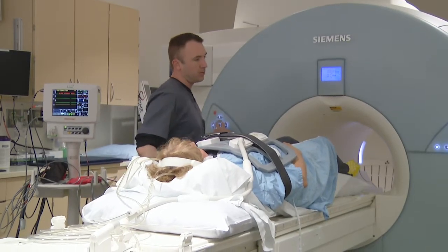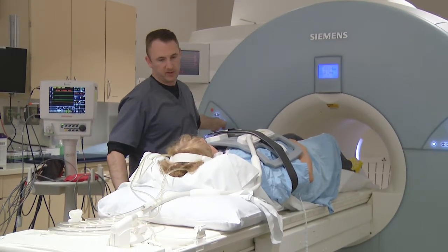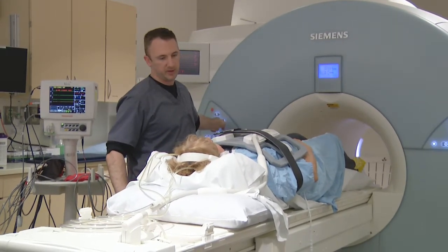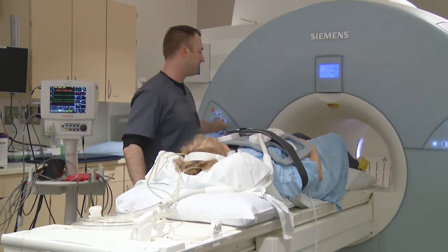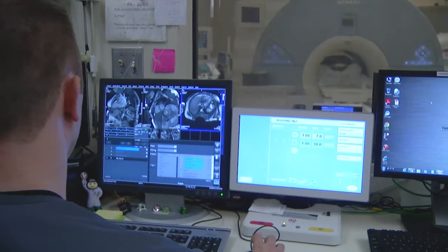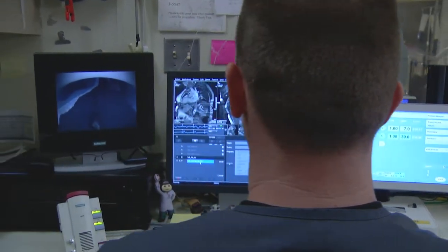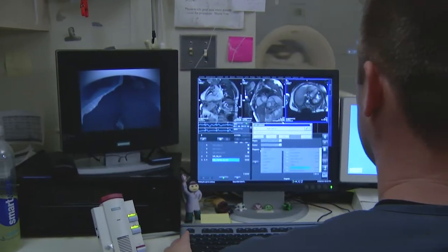If the MRI requires contrast, the nurse will insert an IV. At this point, the patient lays flat on the table and the MRI technologist starts taking pictures. The test typically lasts anywhere from 20 minutes to about an hour.